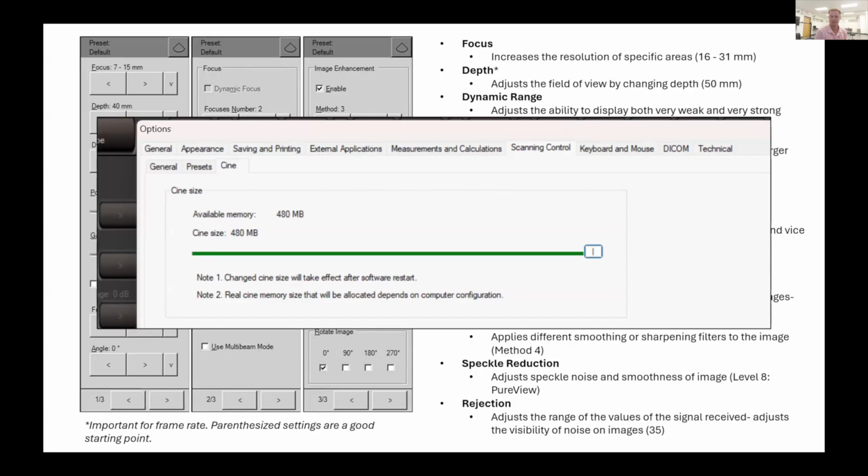But I can imagine maybe if you had a universal timestamp, or you had the date and time in real time from the ultrasound machine and from your video recording device, maybe you could sync things up that way. It's a good point. We should look into that and talk about that.